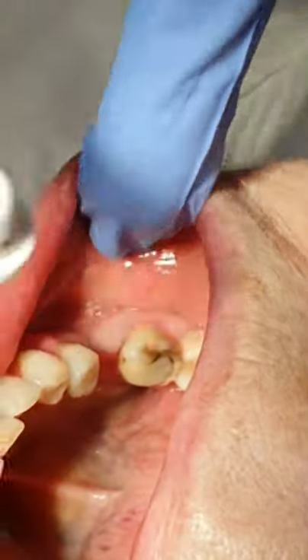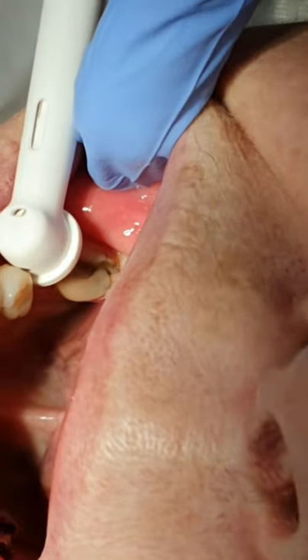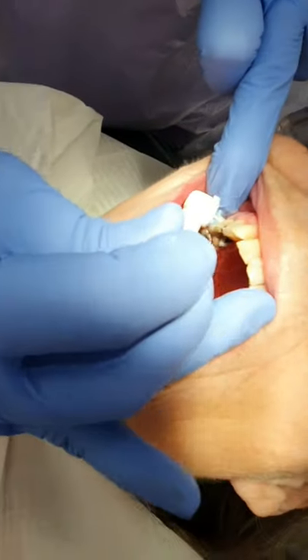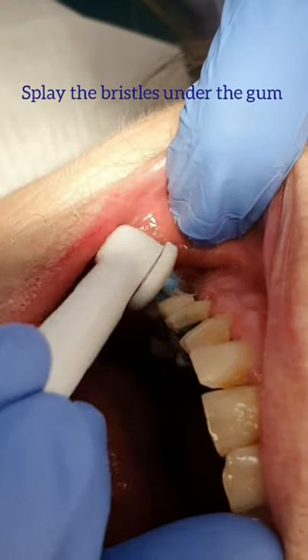So splaying it down — it's quite tight there but it does go in. You feel it going under and that's just wiggling it in and out, and then slide it out of the pocket. Where it is also useful is around sort of crown sites at the top as well, just skirting it very gently. The brush actually splays under the gum as well and you're just working it into these sorts of sites.